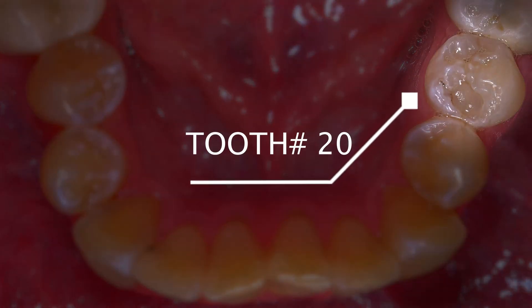This is Sabia Bunnick, CEO and President of Dental Advisor. Today I'm showing a case utilizing Kerr's simplified bulk fill material in a class 2 restoration.